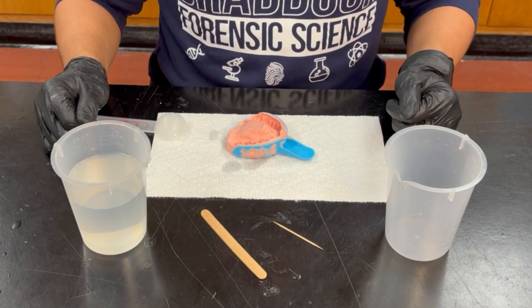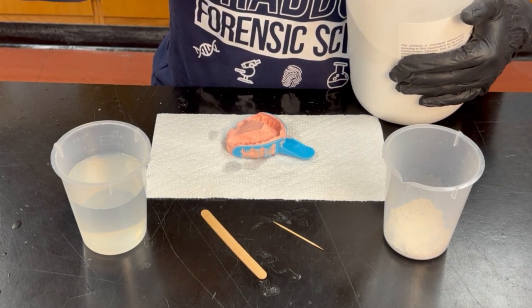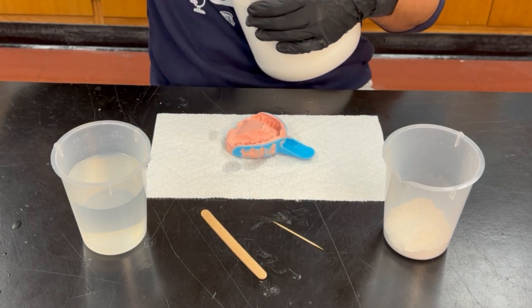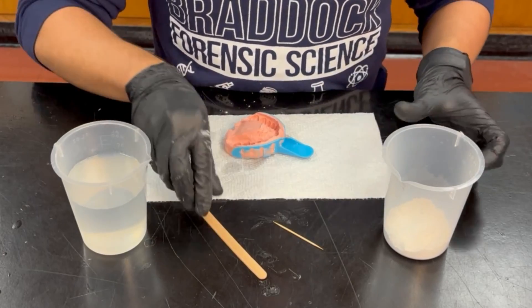Now we are ready to mix the plaster of Paris. This solution calls for equal parts of plaster of Paris and water. However, to increase the detail we can retrieve from the dental impression, we will go slightly over with the water. We will start by adding three tablespoons of plaster of Paris, then mix it with the wooden stick to get rid of the clumps.